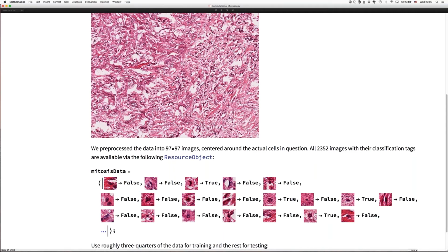Essentially, I just focus in on all these black spots that look like nuclei that could undergo mitosis. And then having cropped all these little cells, I look in more closely, and hopefully now a neural network will be successful by telling that this particular nucleus undergoes mitosis. In this case, it's false, but this particular one, at least according to 3 pathologists that did the screening and came up with a ground truth, or what they believe is a ground truth, is an example of mitosis.